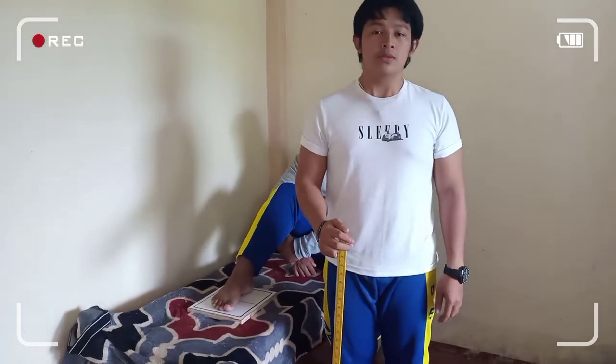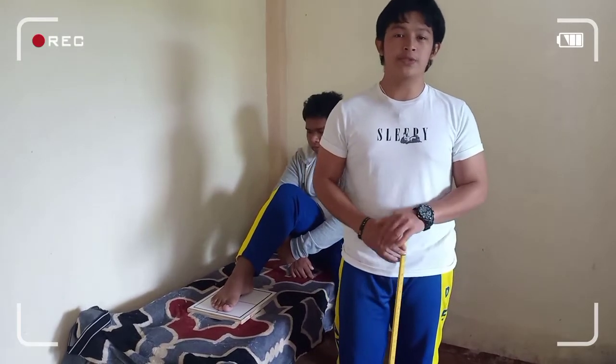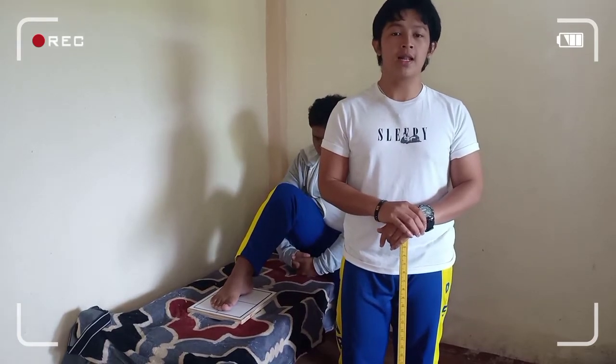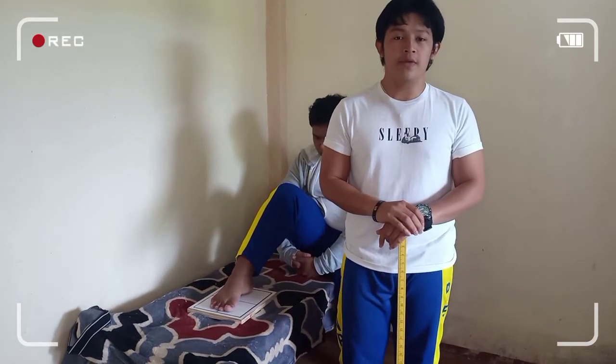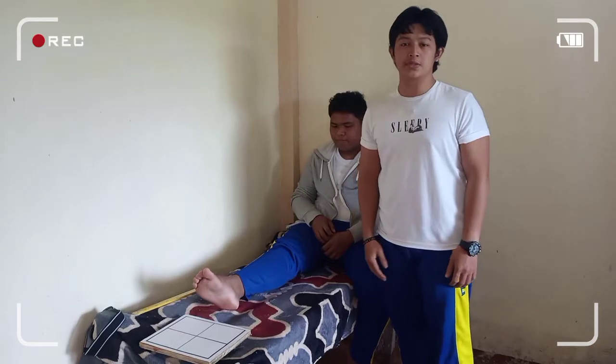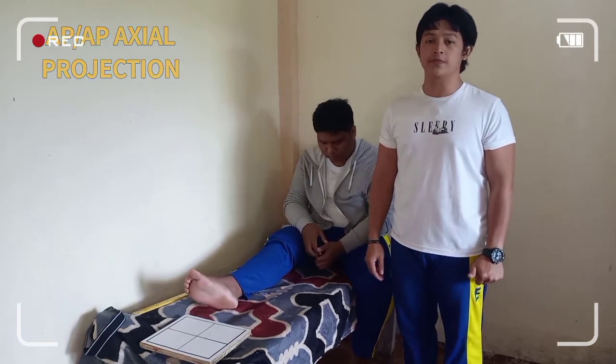Good day everyone. Today, we will be discussing the different projections of the lower extremities, including the foot, ankle, leg, knee, and the femur. The first projection is the AP or AP axial projection of the foot.